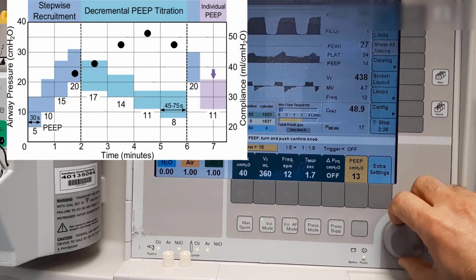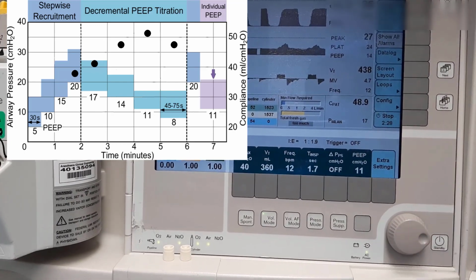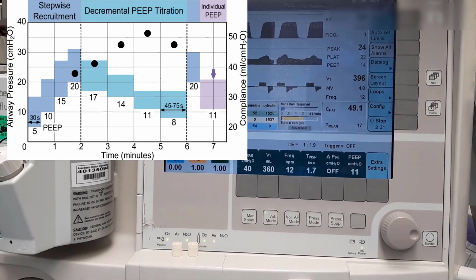Now set the PEEP to the value associated with the maximal compliance. In our patient, this means we are setting the PEEP at 11.